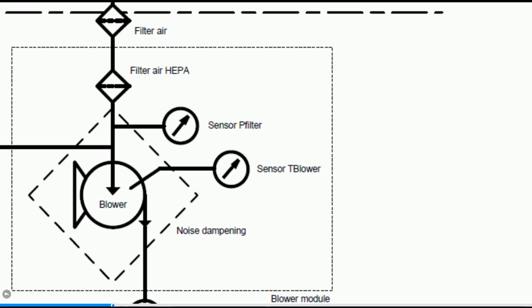The Hamilton T1 does not need an inspiration valve, as the blower generates the complete breathing pattern. This means the turbine quickly reduces speed during the expiration phase and starts up again quickly during the inspiration phase.